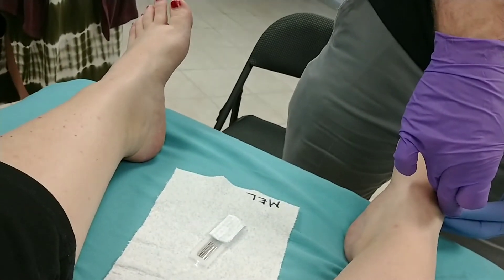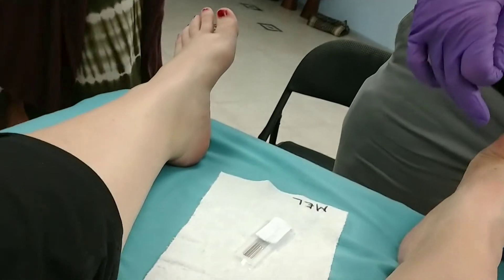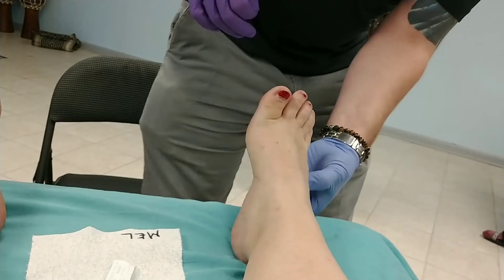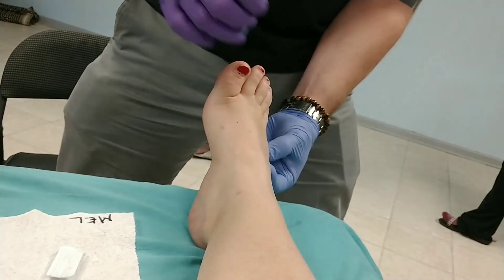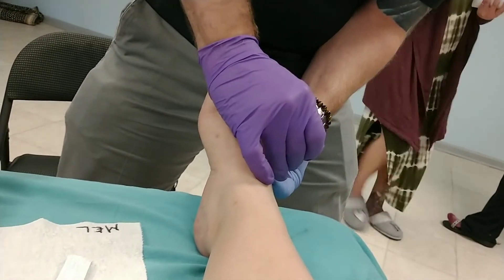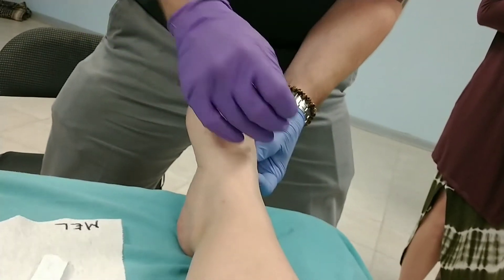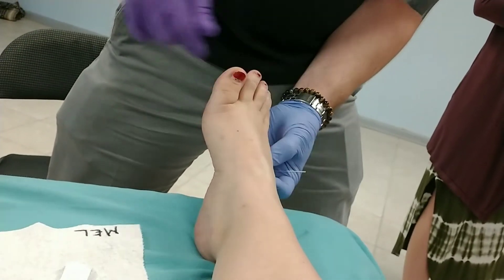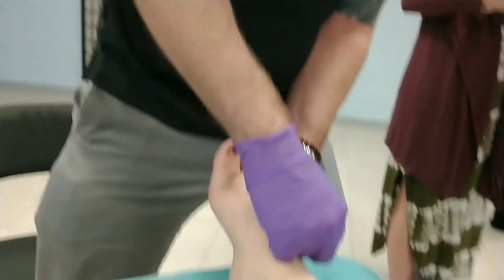When doing this, you have to try to take your pinky toe out to the side. It's hard to control — I can't see what you're doing down there. Spread your toes. This is also not the finest area to needle, but basically we can pincer this off the edge of the metatarsal and more commonly I'll needle from this angle, downward. You can in theory needle up from the bottom, but that hurts more, so don't do that. We can needle down into that one. This is abductor digiti minimi.